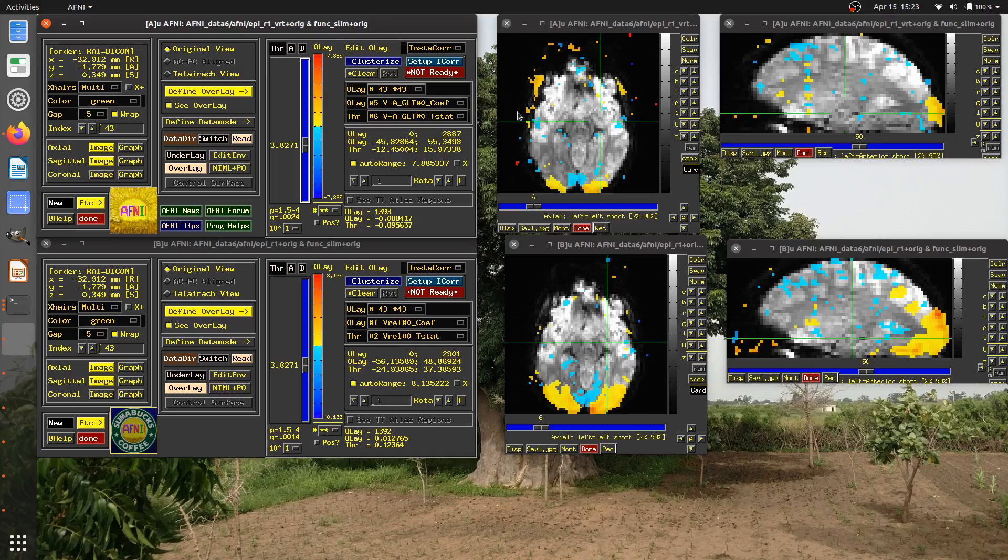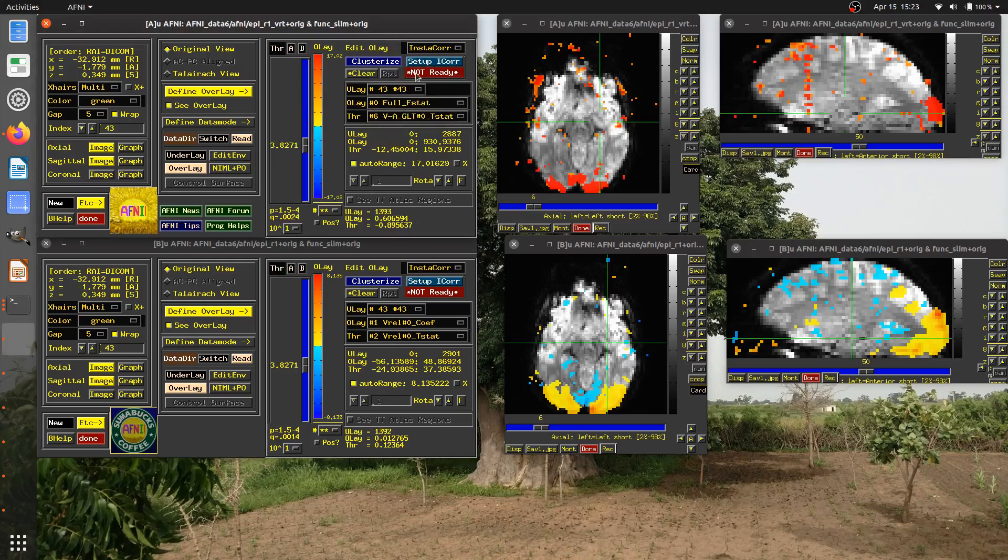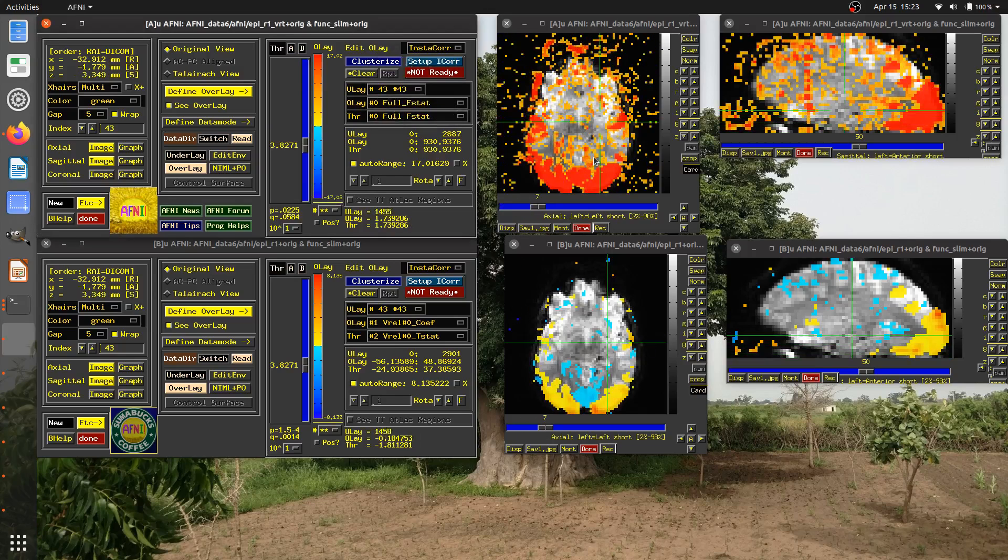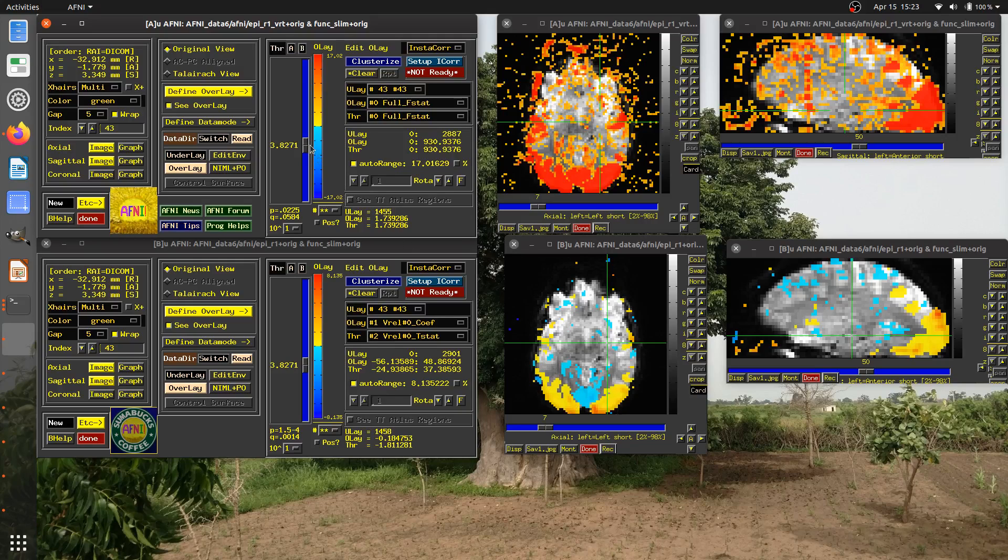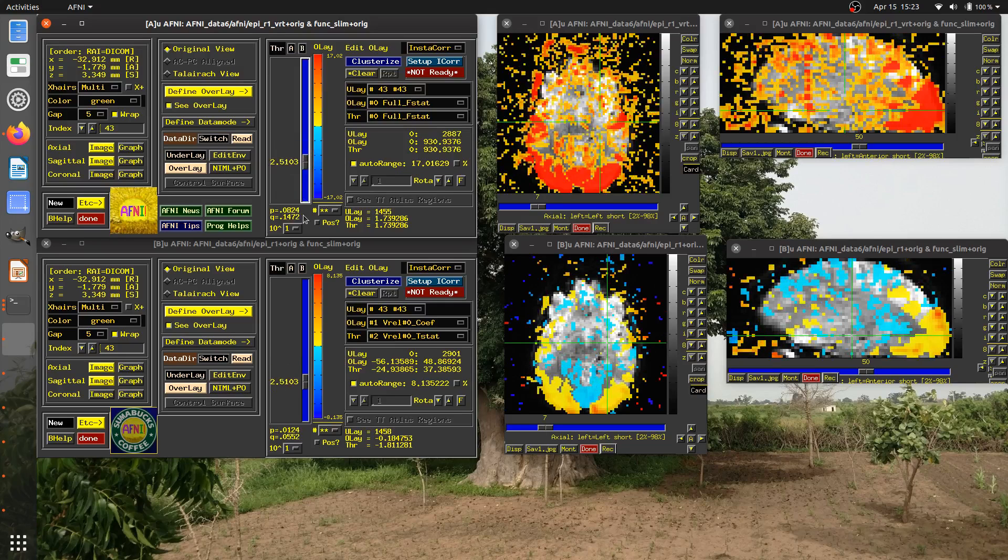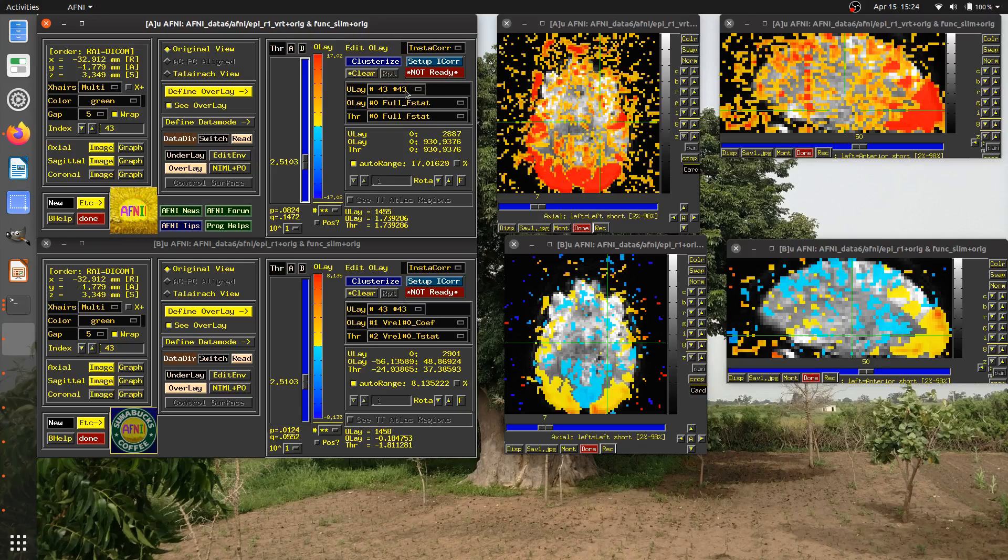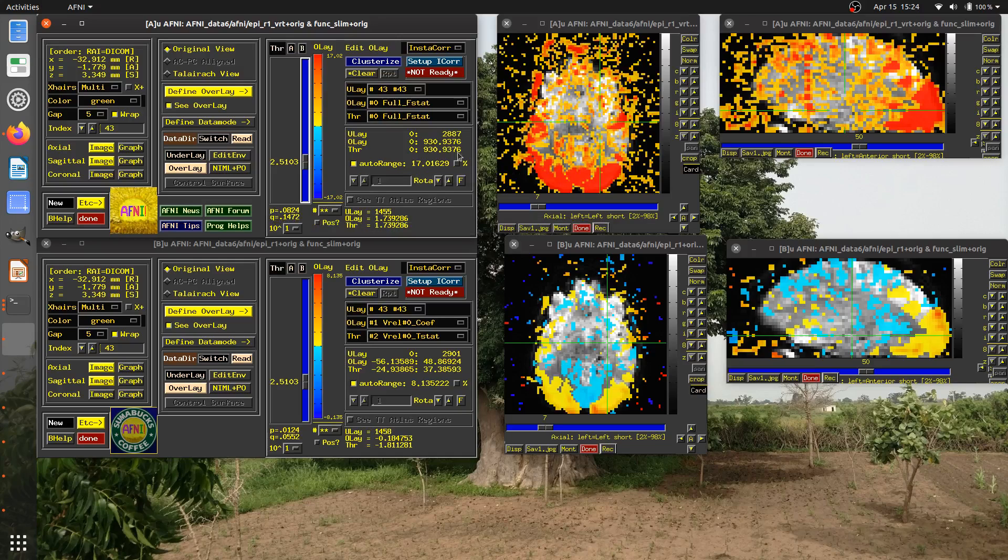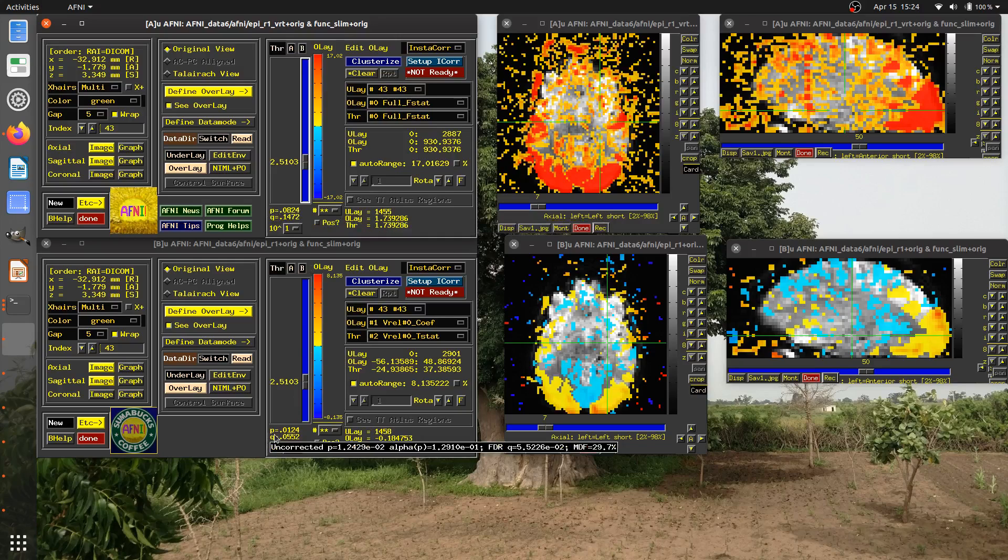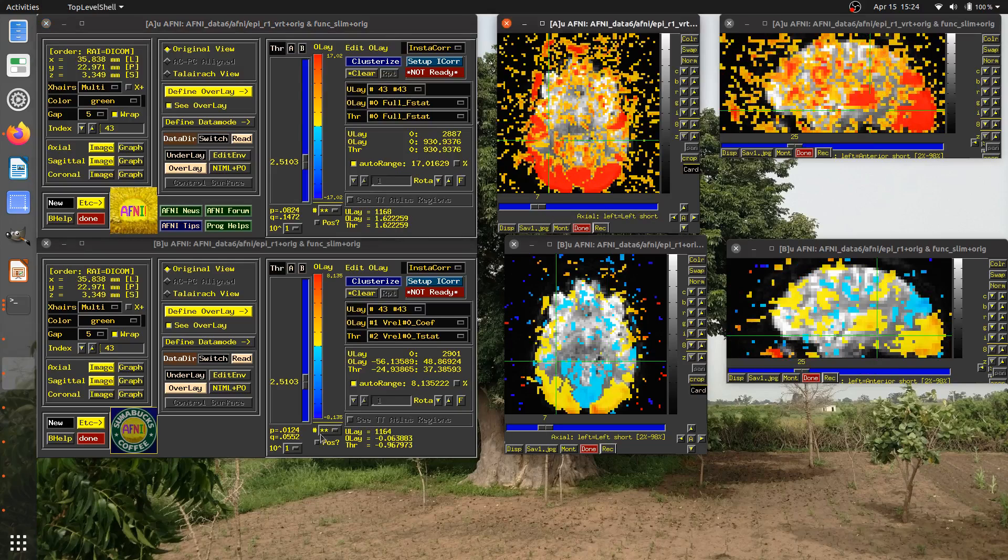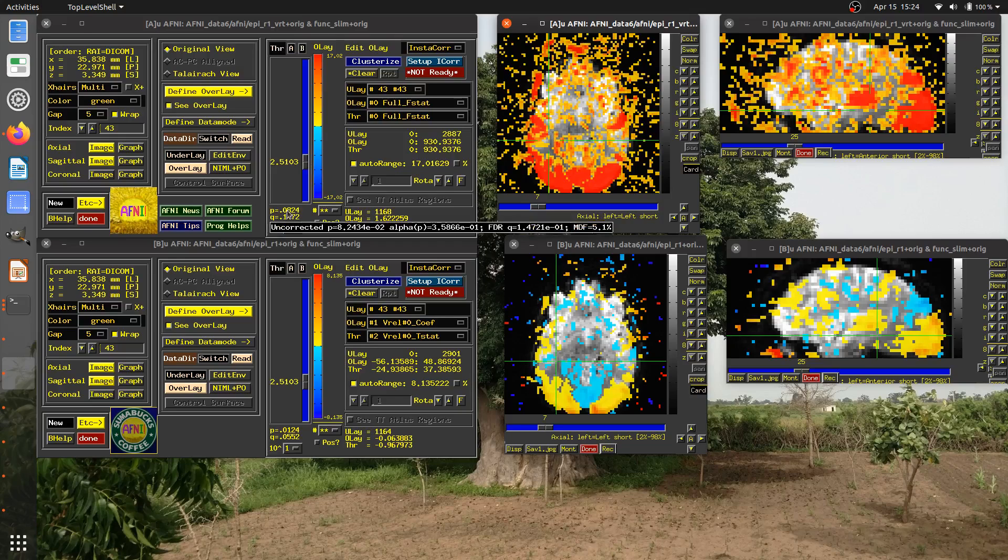Now, what if I wanted to look at this dataset and it's not the coefficient here that from the model of the GLT. If AFNI, let's say I wanted to display and threshold with the F stat. So the F stat's a very different type of dataset than here. And now if you notice, the thresholds are locked together, but let's look here at what the corresponding P value is. If I threshold this F stat, the value of the F stat of 2.5 in this dataset has an associated P value for a two sided test of 0.08. What is the P value of this data set? It's 0.01. So while the thresholds are locked together for these two different statistics, they each have a different P value, a different corresponding significance.